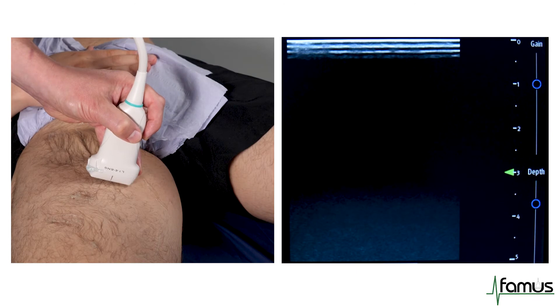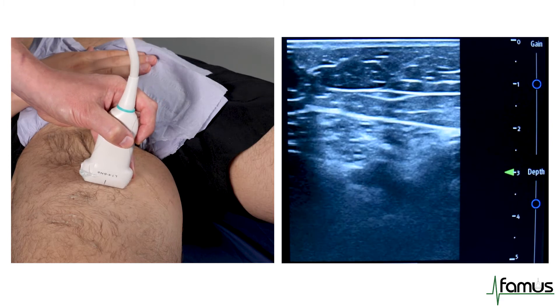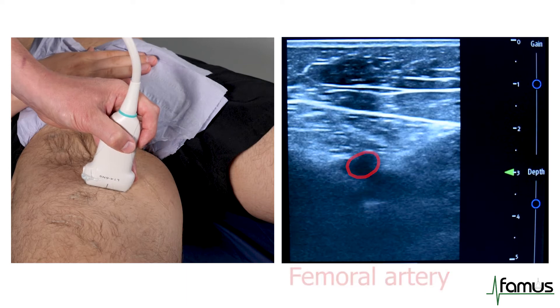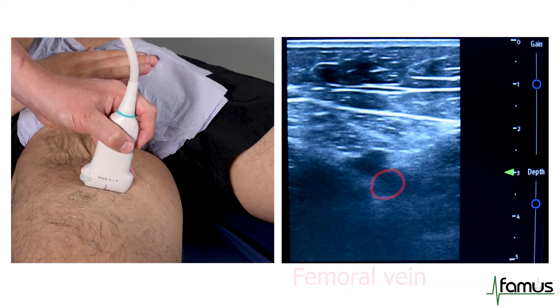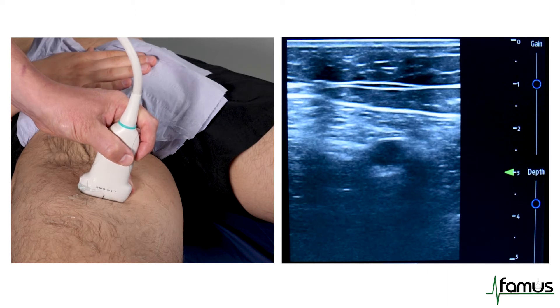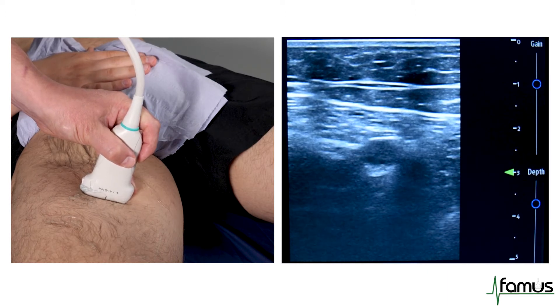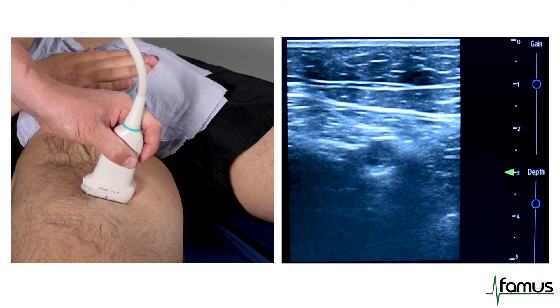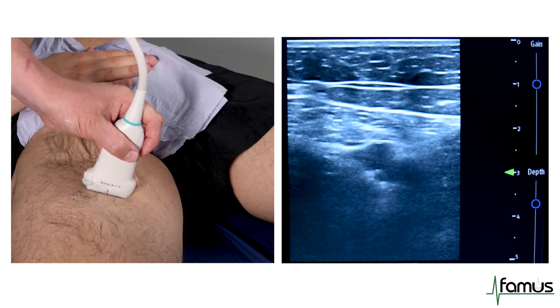The second point of scanning is the midpoint of the thigh, with the probe in the transverse position and the dot pointing towards the right-hand side of the patient again. We can see immediately into view the femoral artery and the femoral vein. As I apply pressure, the femoral vein walls completely collapse, and the pulsatility of the femoral artery really comes into view. As I release, the femoral vein fills again.